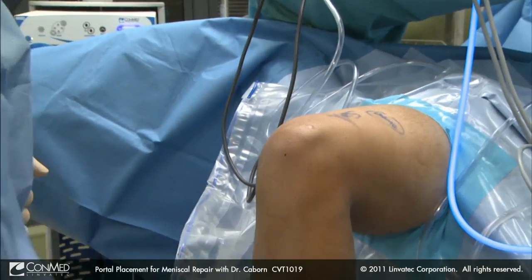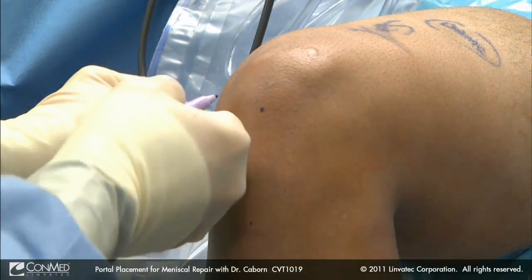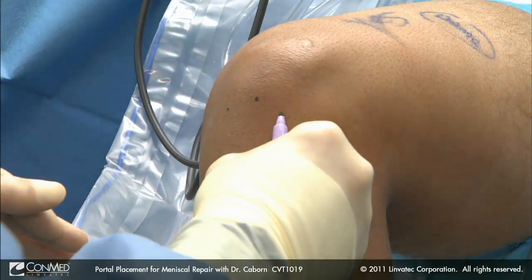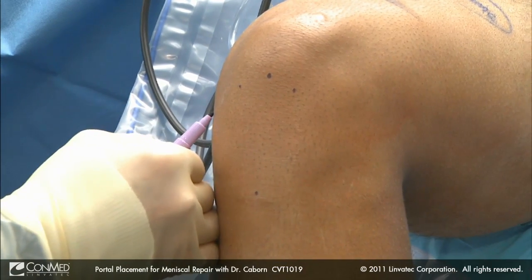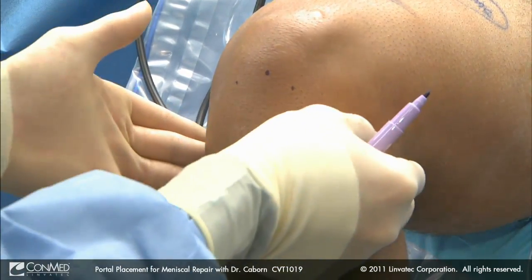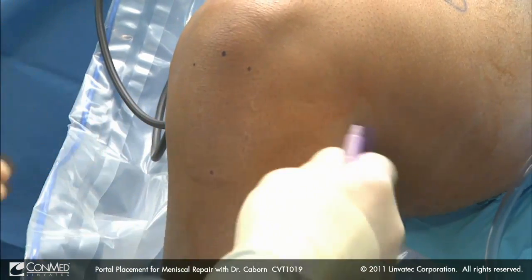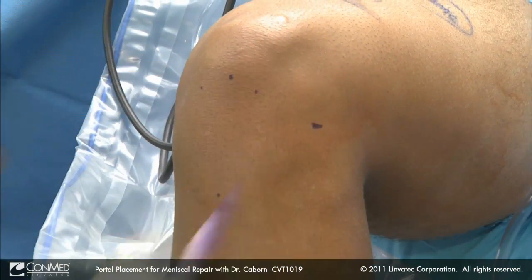We like to mark on the inferior pole of the patella and the tibial tubercle. We mark on both sides of the patellar tendon, on the medial joint line, and on the lateral joint line. That gives us an idea of our portal placement.